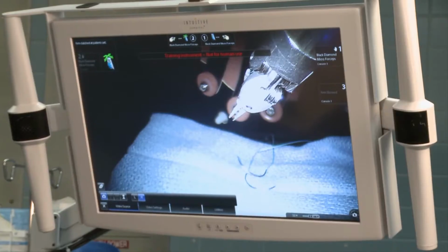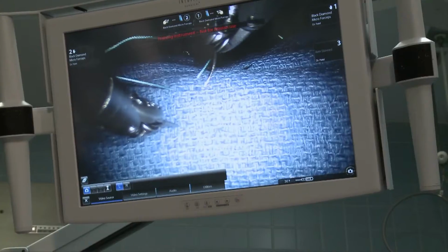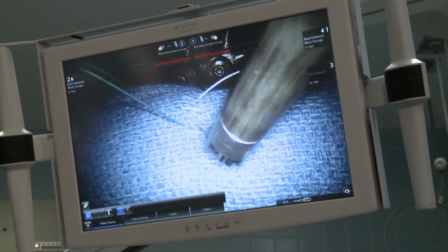As soon as I look into it, the robot starts moving. And procedures underway inside the patient are much more precise. These delicate, flexible instruments operate with an almost infinite dexterity in the smallest of spaces. I was reading you can do beating heart surgery with this. Yes. Explain what that is.